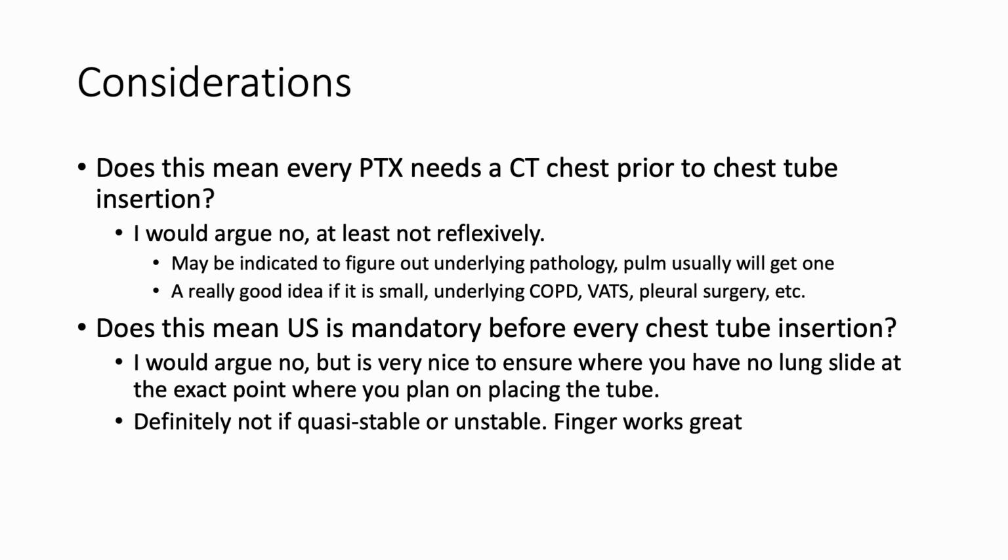Also, considering my case, does this mean that you have to do ultrasound before every chest tube? Well, I would argue no as well here. I think that it's nice to do, and it's nice to have at the bedside when you're doing it to give you that additional confirmation that you're going to put the needle into a spot that definitely has the lung down. But I think there's a lot of situations where we've got really impressive pneumothorax. Everything is fitting with pneumothorax, and it's really not somebody who's got a lot of underlying lung disease, and it's a fairly straightforward case.